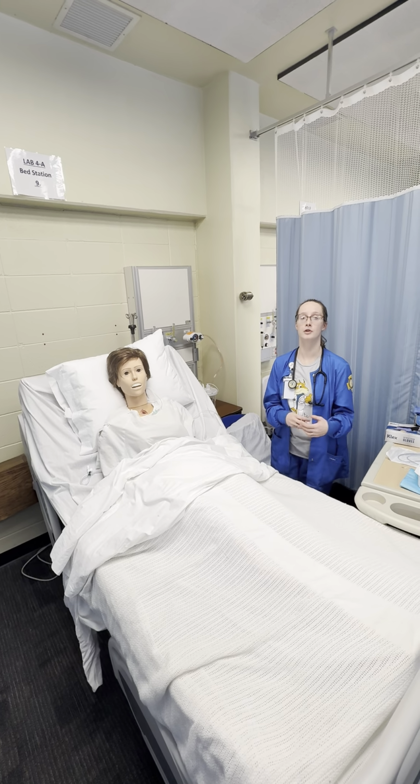First off, I'm going to do my 2 patient identifiers. I'm going to assess for allergies. And I'm going to make sure that my patient is in an appropriate position. She is at a 45-degree angle, and I've had the bed put to a good working height.